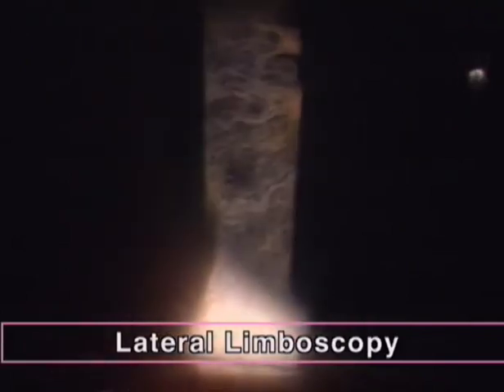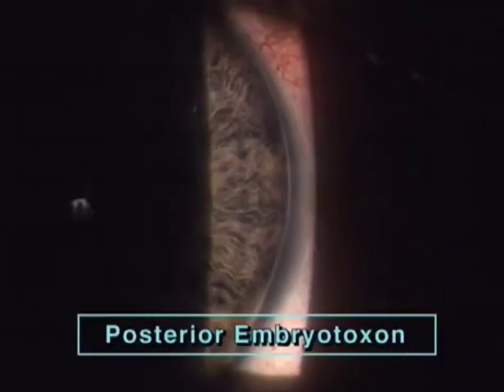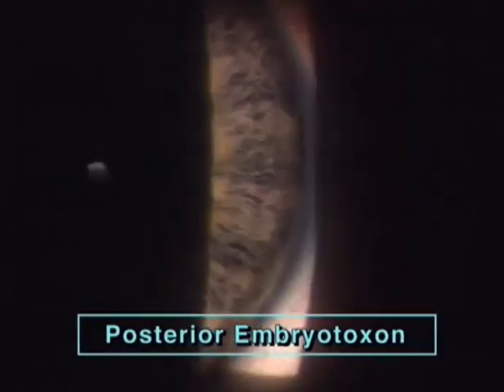Another non-contact access to the angle is lateral limboscopy. Here we obtain an outside view on Schwalbe's line in a posterior embryotoxon. We can examine the embryotoxon in direct light and in indirect illumination, whereby its glass rod properties become apparent.